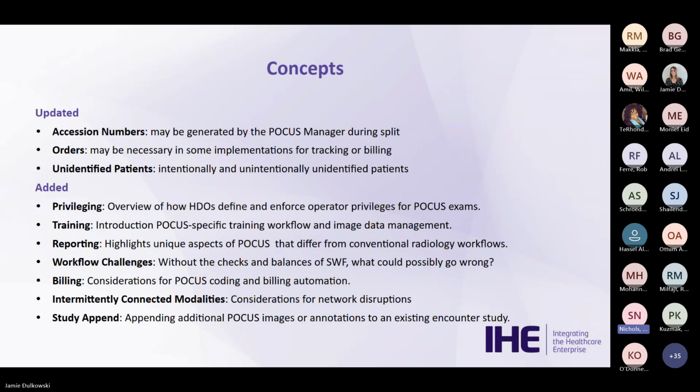If you consider scheduled workflow, it has inherent checks and balances because of the multiple people that are involved, so things usually work out fairly well. Well, in point of care ultrasound, you really have a clinician who's performing, reporting, and archiving, responsible for archiving the images. So you really have a single failure point. And so we wanted to highlight some of the challenges that come along with that.